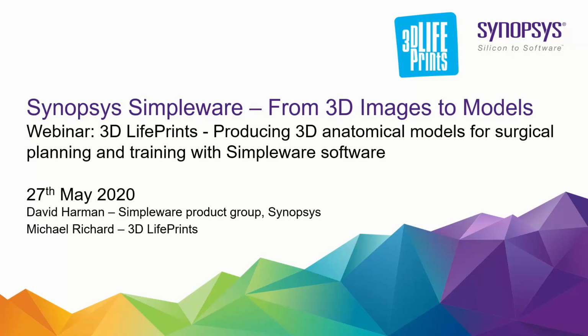So with that overview of the Simpleware software, I hope that gives you a good introduction to what we can do. At this point, obviously, I want to hand over to 3D LifePrints to give you an overview of their products and their capabilities and how they've used the Simpleware software within their workflow. They're really going to show you exactly what they can do and how they've positively affected clinical outcomes with their models and helped people live better lives through planning with the anatomical models that they've been able to provide. So here I'll introduce Michael Richard, the Head of Engineering at 3D LifePrints, and he will take you through the slides that 3D LifePrints have put together. Thank you very much.